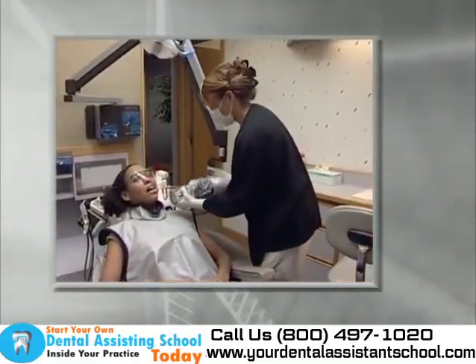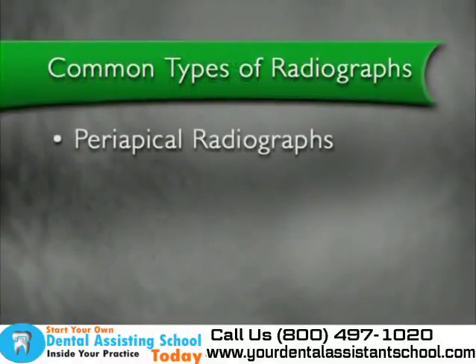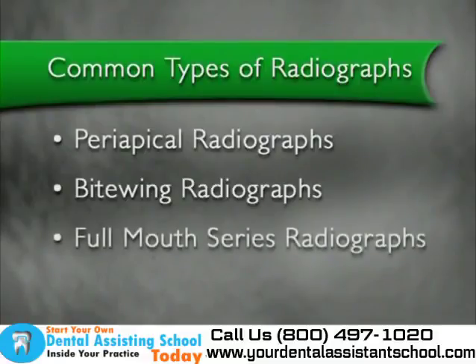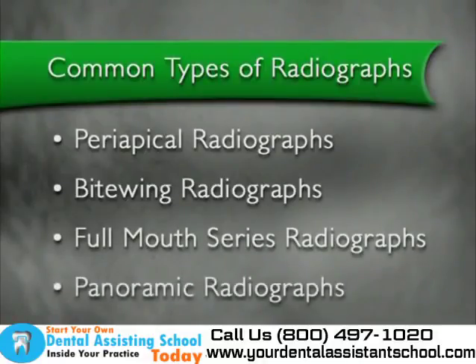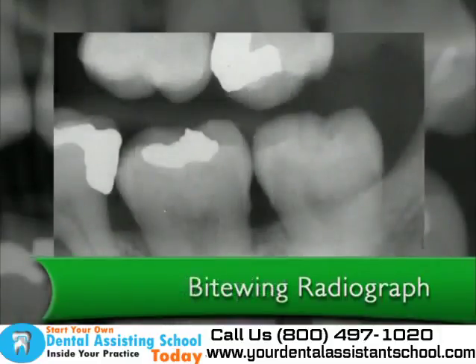Dentistry utilizes many different types of radiographs. The most common are periapical radiographs, bite wing radiographs, full mouth series radiographs, and panoramic radiographs. The periapical radiograph displays two or three teeth in their entirety, including the roots and crowns, along with sections of the surrounding tissue. Generally, the dentist uses this type of film when looking for problems of the root and surrounding tissues. The bite wing radiograph displays crowns on the upper and lower arches.